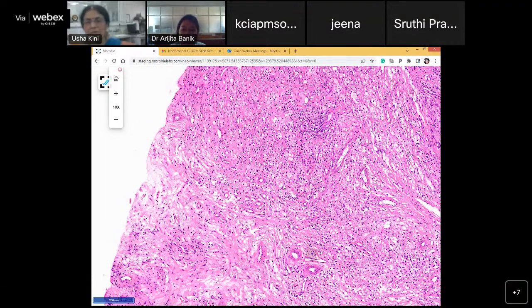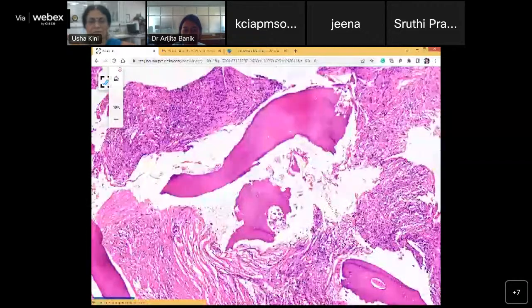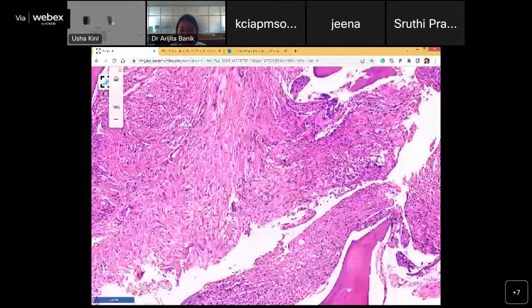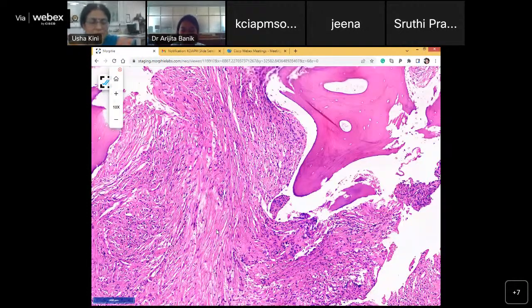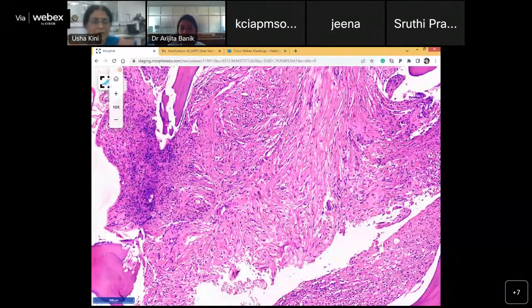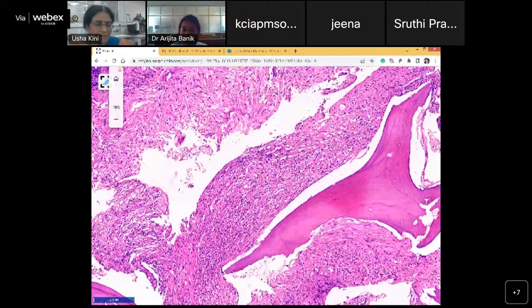Okay, very good. So when you have both viable and dead bone, diagnosis? You have said that already. My differential is, ma'am, xanthogranulomatous osteomyelitis. Okay, dead and viable osteomyelitis. You see foam cells with giant cells, maybe there's xantho. And then there is that woven bone being formed. I feel maybe the tissue is healing. But strangely, later, I'll tell you what happened to this patient. He gave me a history which went very well with it.